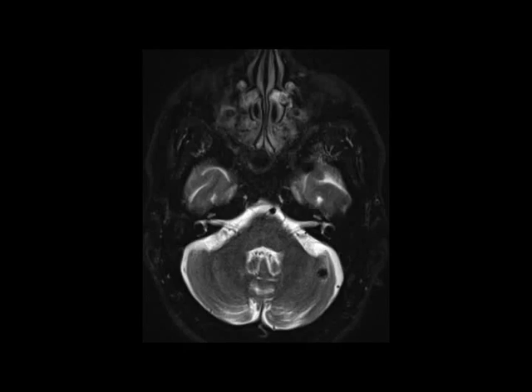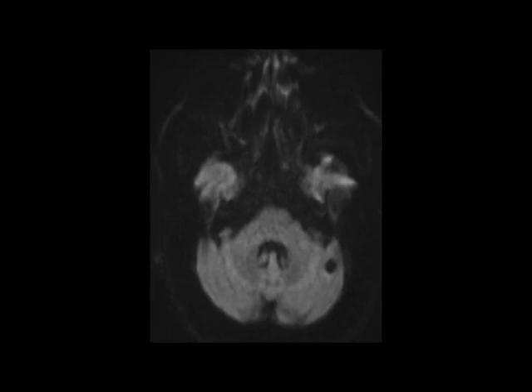This is a 26-year-old female who presented for new seizure-like activity within the left cerebellar hemispheric folia. There is a rounded subcentimeter lesion with hypo-intense signal on the T2, diffusion-weighted images, ADC maps, SWI, and FLAIR-weighted sequences.